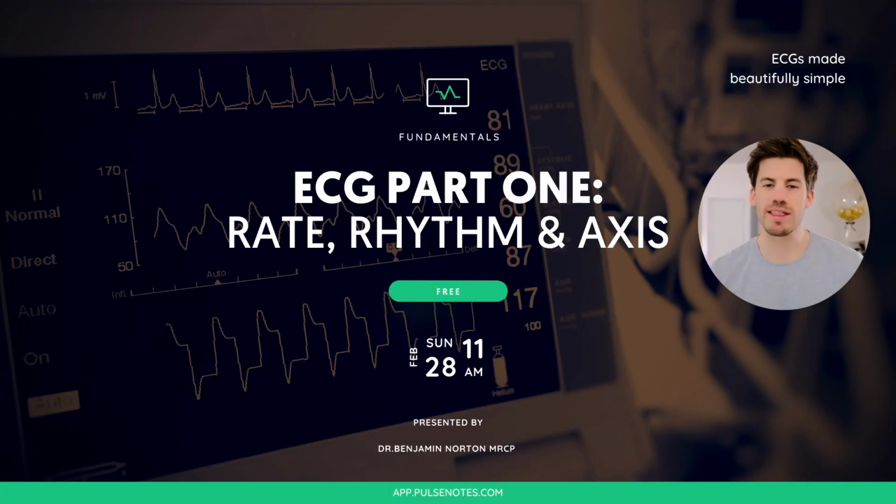And today we're going to be tackling the first of our 6-part series where we're really going to be focusing on the ECG and how we interpret the ECG. This is part of our fundamentals series where we focus on some of these basic clinical skills and will help you build in clinical practice. In this first part, we're really going to be looking at rate, rhythm and axis.